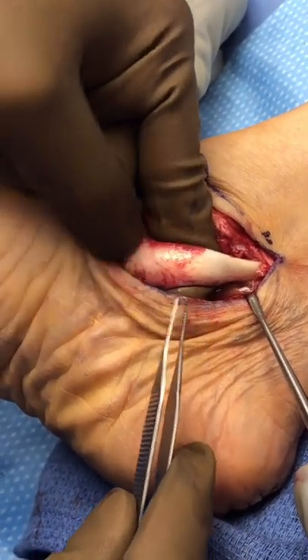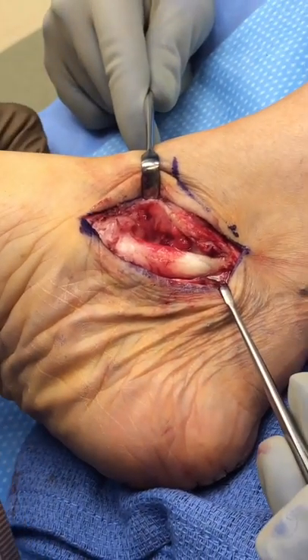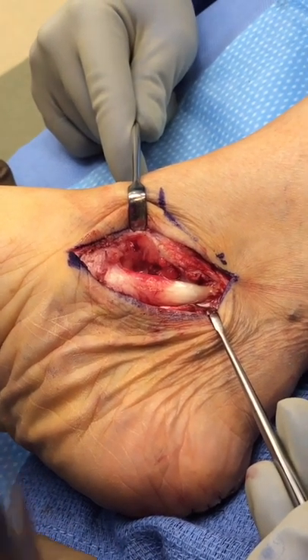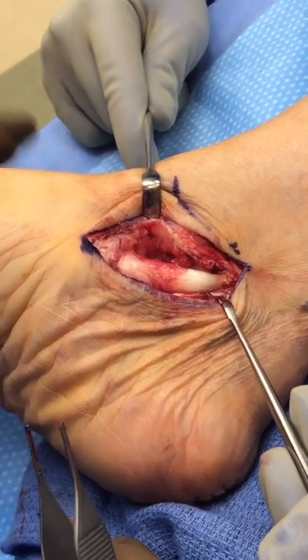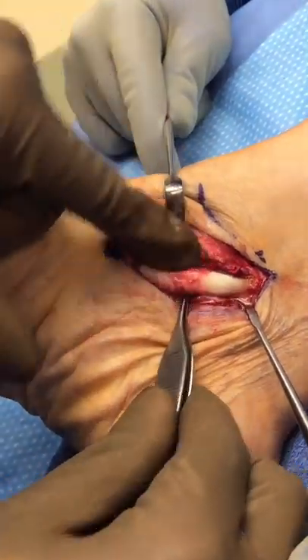This thickening is due to the chronic tugging of the tendon, which subsequently elongates, leading to the flattening of the foot. Now that we've corrected the arch with the bony work, we'll go ahead and remove the diseased tendon.